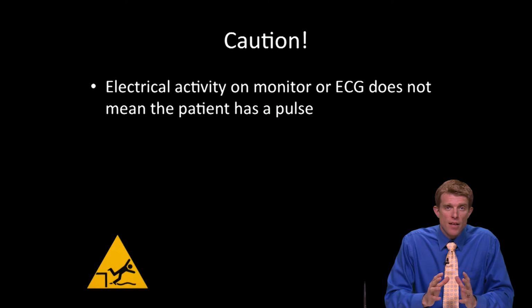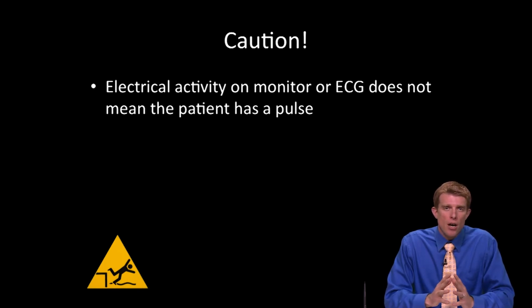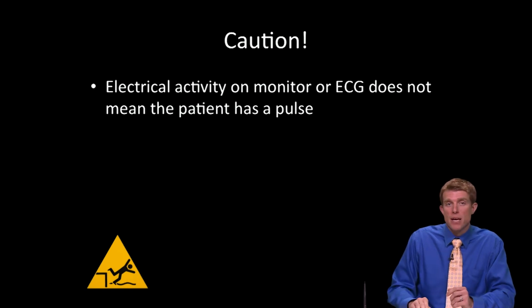What they find then is that the patient is actually pulseless and in pulseless electrical activity. So remember that when you're looking at a monitor or an ECG, you're looking at the electrical activity of the heart, but not necessarily the mechanical functioning of the heart. So always confirm whatever heart rate you see on a monitor or ECG with the patient's pulse at the bedside.